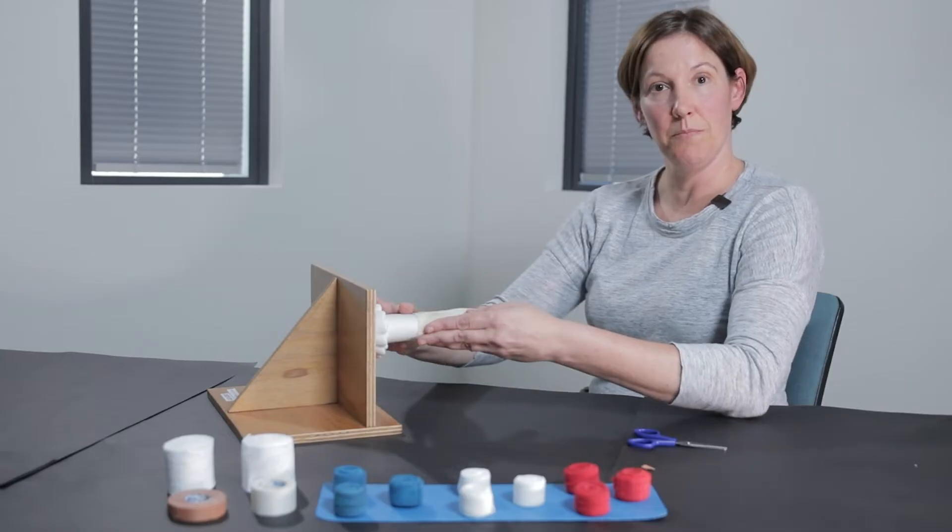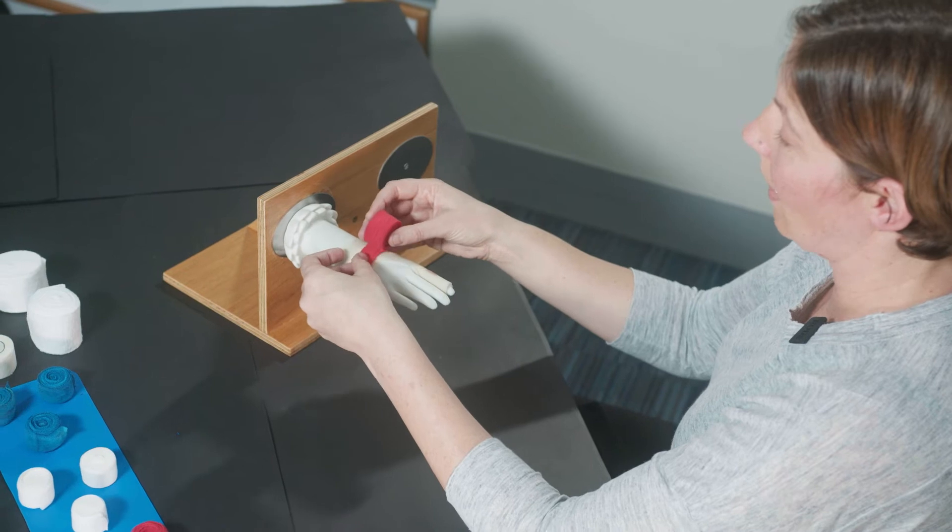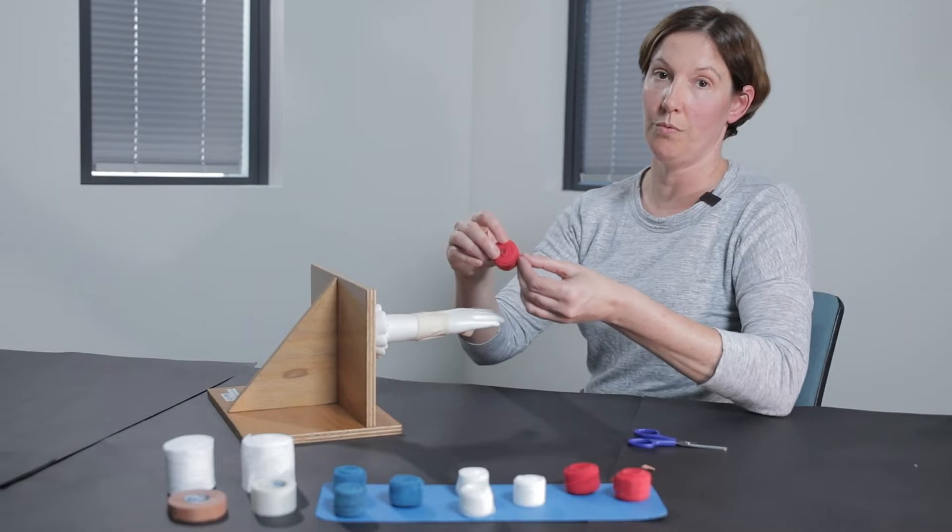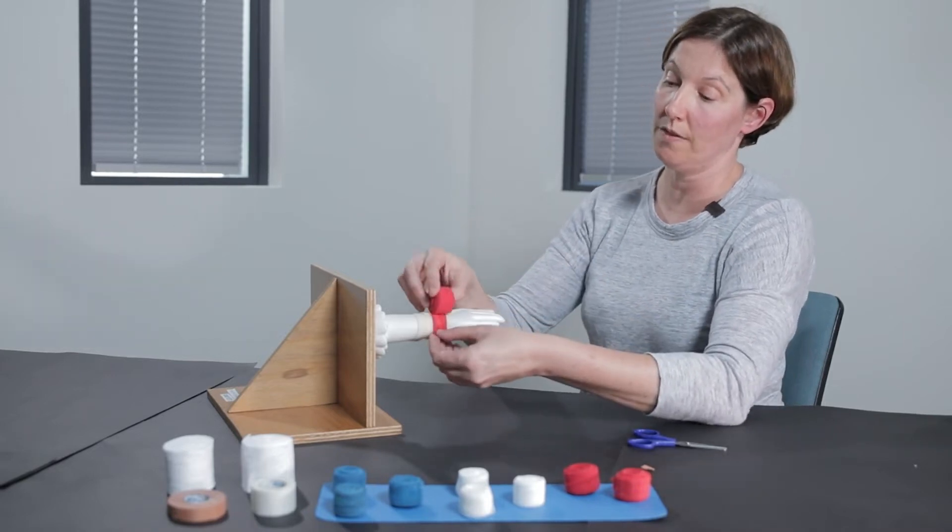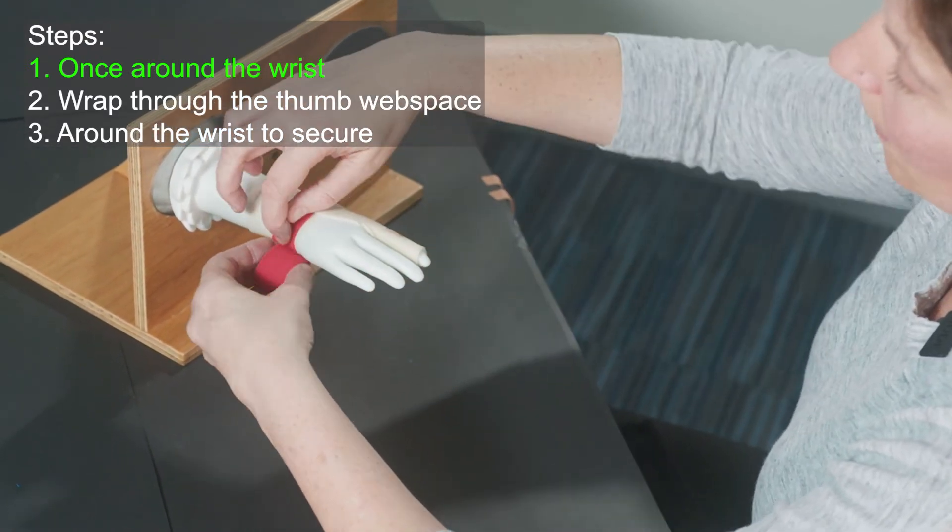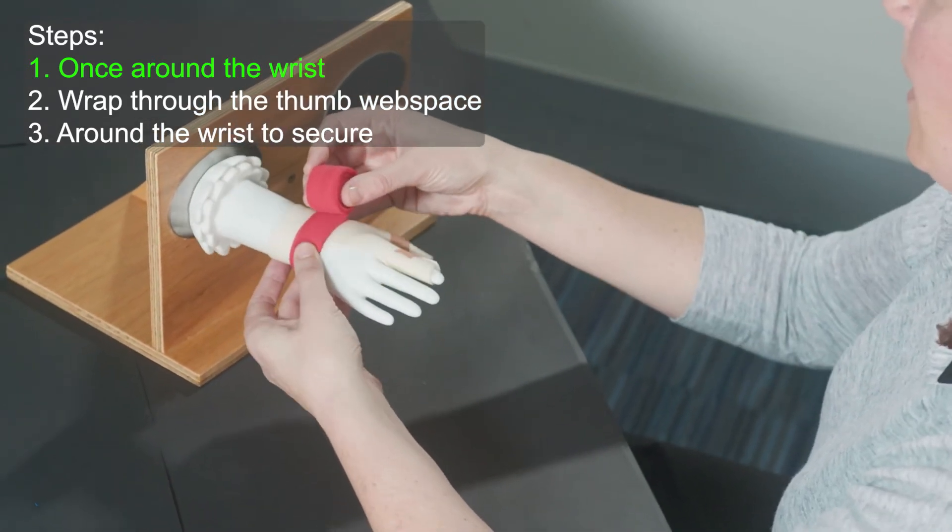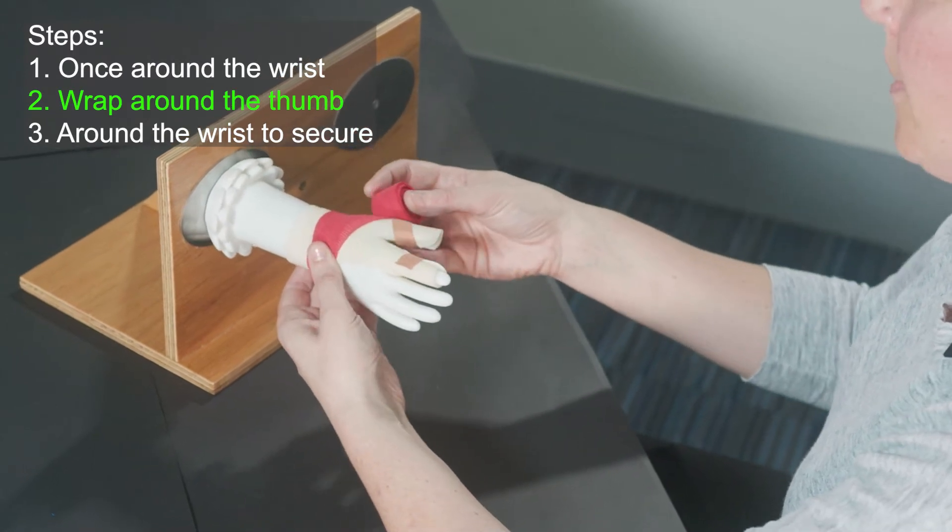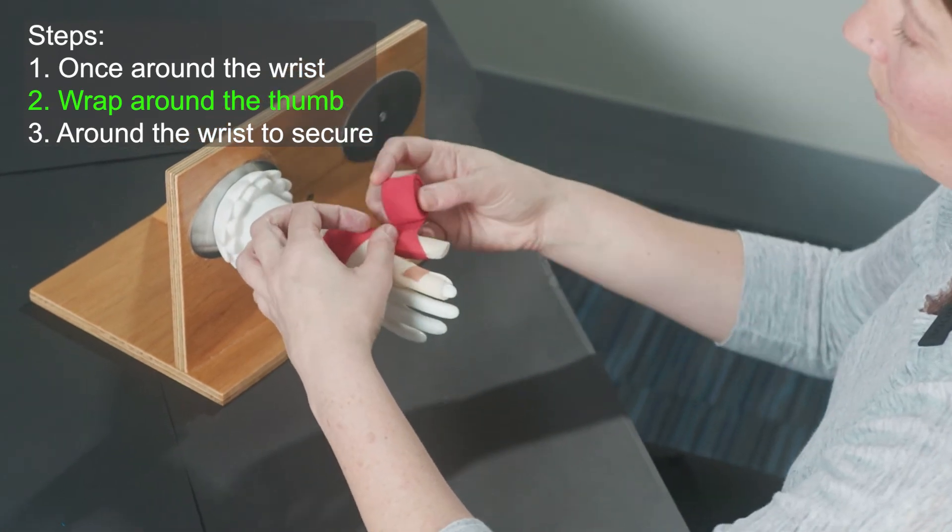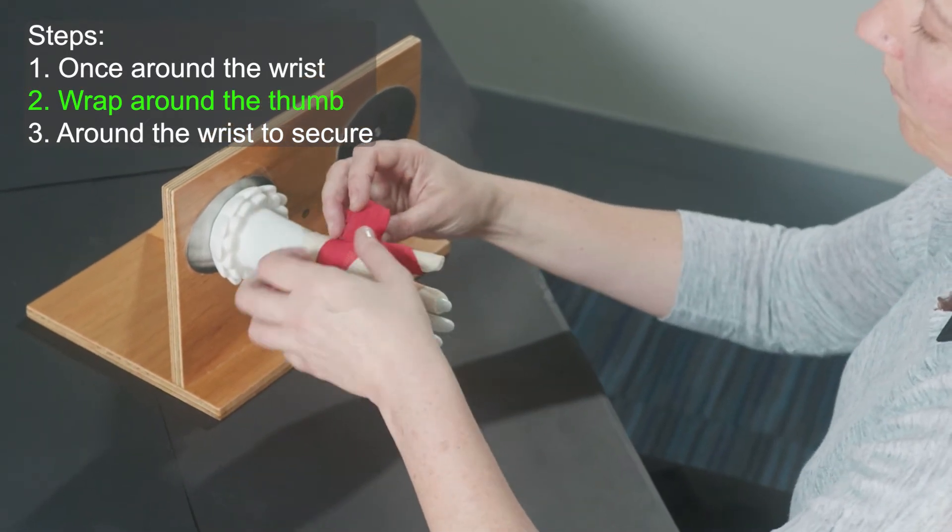Once your dressing's in place, you're going to take your very soft wrap and we're going to start wrapping. The way that we wrap, you're going to hold your wrap on one side and you're going to be wrapping towards the thumb, keeping the wrap close to the body. We're going to secure it once around the wrist, and we're going to start by wrapping the thumb. This technique I'm going to show you is just for wrapping around the fingers. You can do as many wraps as you need up and around each individual digit.